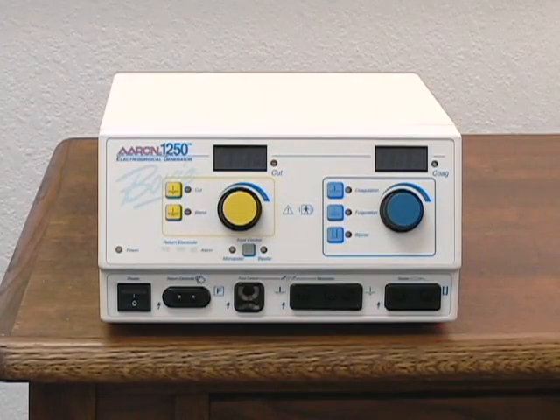Before operating your unit, be sure to read and understand all safety warnings and cautions referenced in the user's guide.